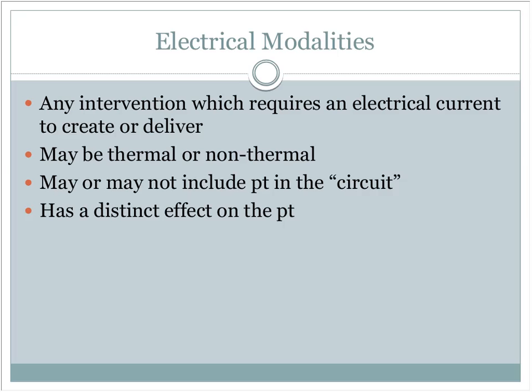If, on the other hand, you are using electrical stimulation through the sound head as part of a combination treatment where you're doing E-stim through the sound head, of course they should be feeling that, but you should also have another electrode placed somewhere on the patient so that the electricity can go through the sound head and into that electrode and back to the machine. So, also, electrical modalities, when we talk about them, they certainly should have a distinct effect on the patient.